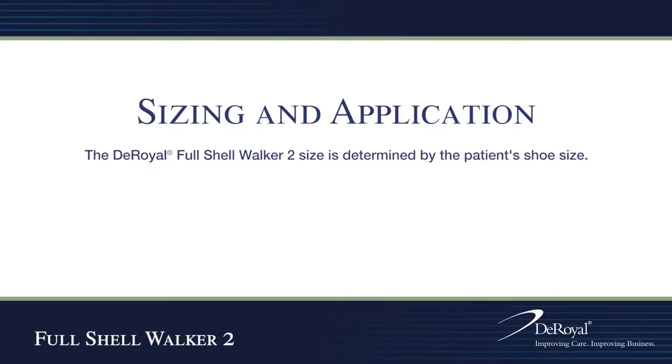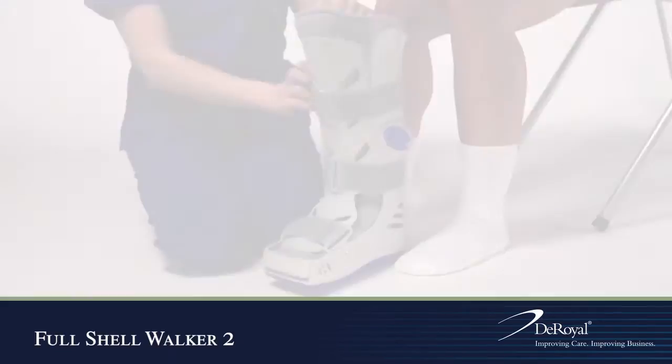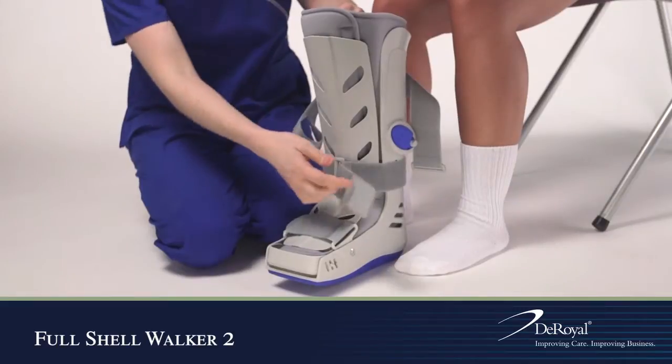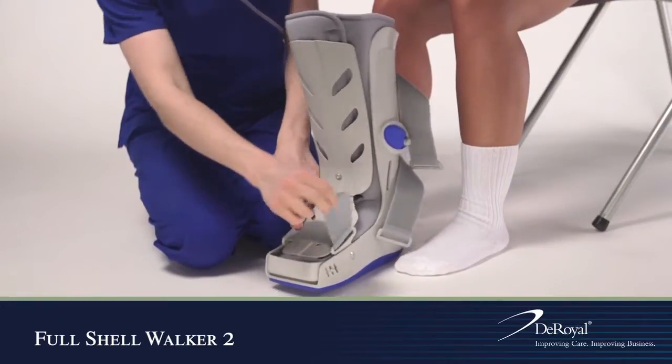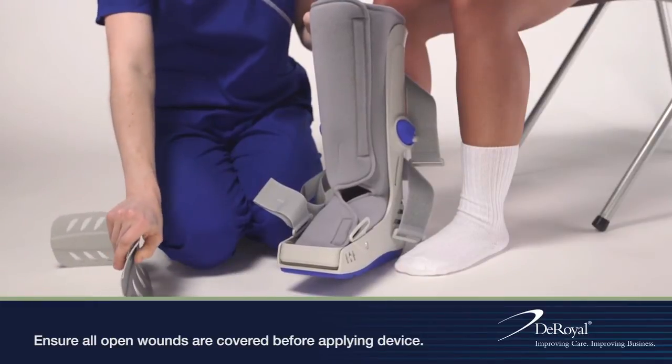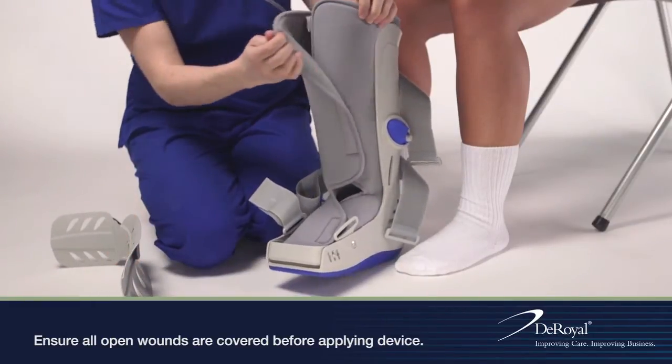The DeRoyal Full Shell Walker 2 size is determined by the patient's shoe size. Prior to application, unfasten the hook and loop straps. Remove the anterior panel and open the calf and foot liner completely.